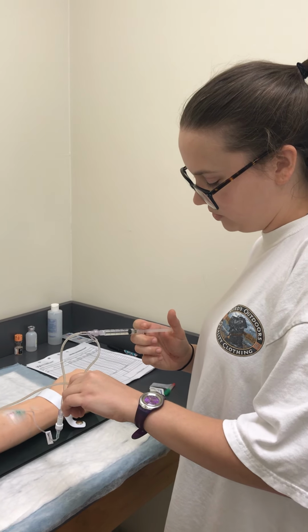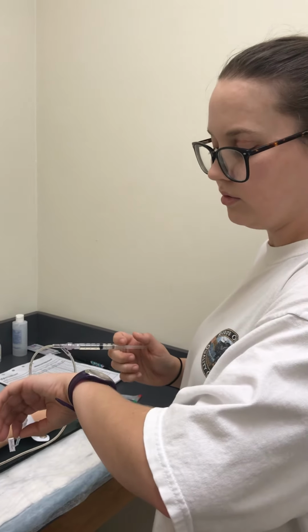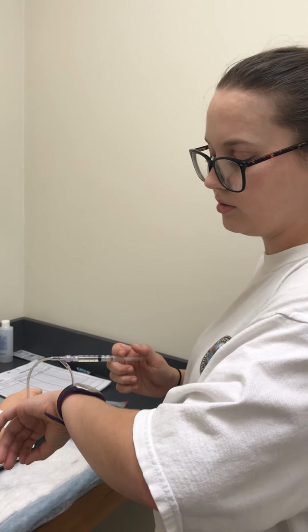I'm administering 1 milliliter. I'm gonna let go. While I'm administering, I'm gonna be watching my patient for his response.